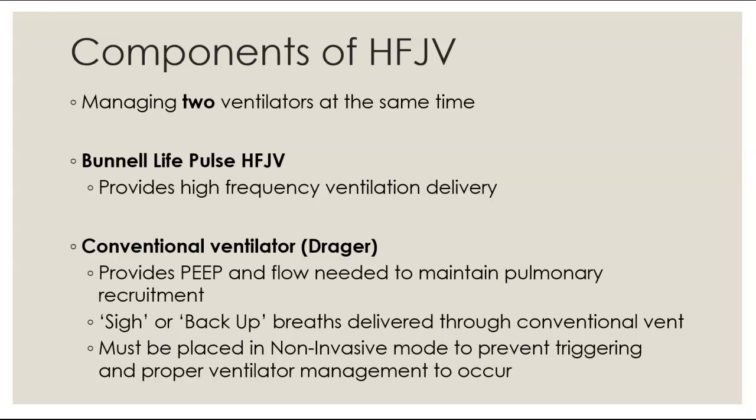You can deliver sigh or backup rate. They're the same thing, but again, respiratory therapists can't make it easy and use the same term for the same thing. But these sigh or backup rates would be delivered through the conventional ventilator. And again, just like I said, it must be placed in non-invasive mode to prevent triggering and allow proper ventilator management to occur. If we were in an invasive mode, every single one of those high frequency breaths would trigger it constantly, and that would cause a lot of pulmonary damage to our babies.